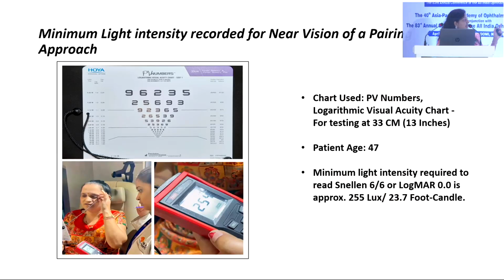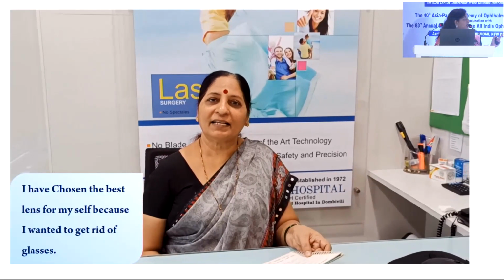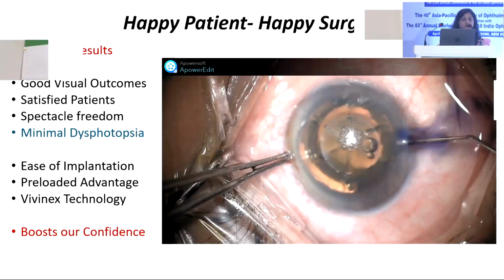So we use this light meter, and you can see that 255 lux is the minimum light intensity required to read. This was a patient who actually was extremely happy, and she was able to read for distance, intermediate, as well as for near without glasses.